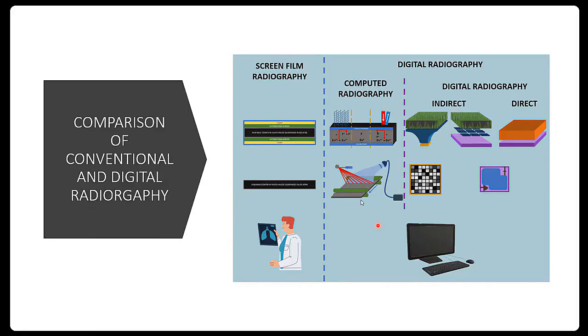It can provide image access to multiple users at the same time, on demand images, electronic annotation images, and specialty image processing. The first full scale PACS in the United States was installed at the VA Medical Center in Baltimore in 1993. So PACS was first installed in 1993.